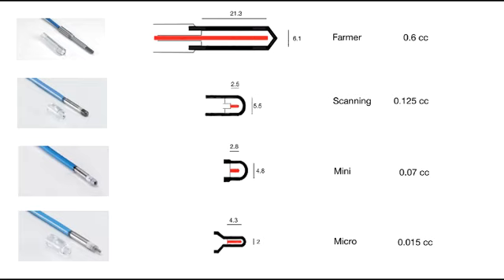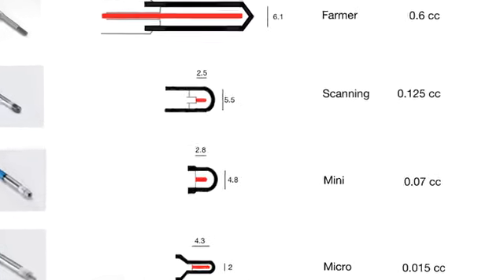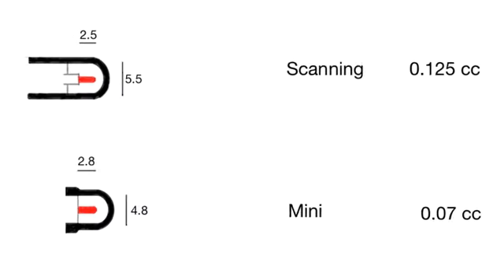So you get a less noisy reading, more accurate reading. So that's one of the key reasons why a Farmer chamber is used for absolute dose calibration, to say how many centigray per MU, let's say, are used in your beam. But let's look now at some of these other chambers down here.